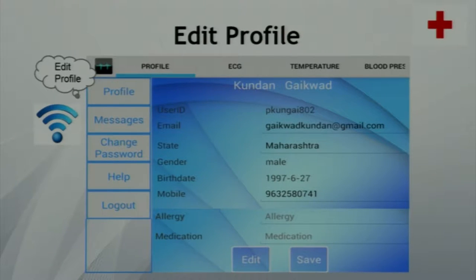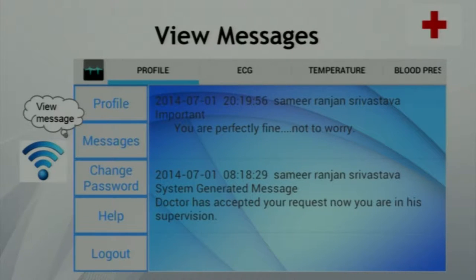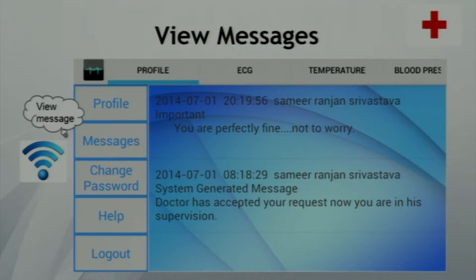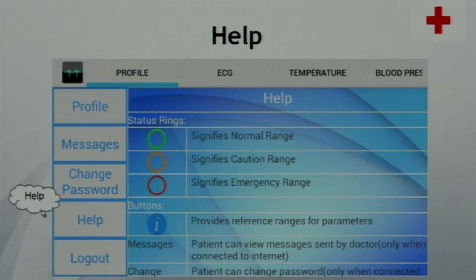For the registered user, there is a special profile tab showing all his details. If internet is available, the user can edit his profile and save it. There is also a messages button — when clicked, all messages sent by the doctor are displayed. The user can change his password using the Android app. There is a help button with details on how to use the app, and a logout button to exit. After this, Sameer will explain the web application.